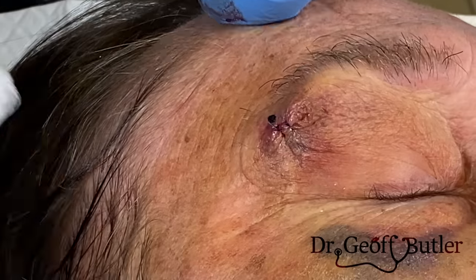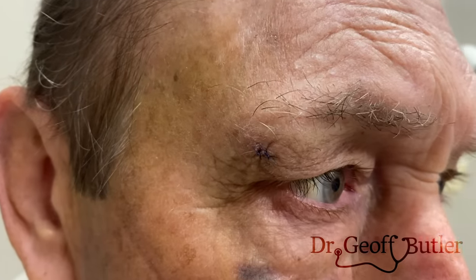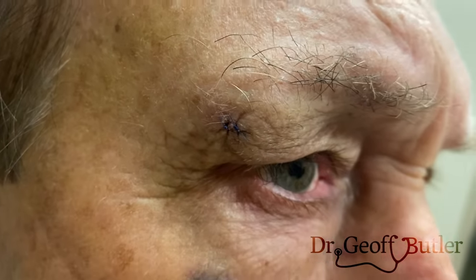That should be pretty good — I'll leave those ones alone and we'll see him back in a while for follow-up. This is the follow-up of the hematoma that we evacuated. You can see from an anterior perspective that the alignment is good and it's healed nicely. There are two stitches still there — we're going to take those out today. That's a good result.